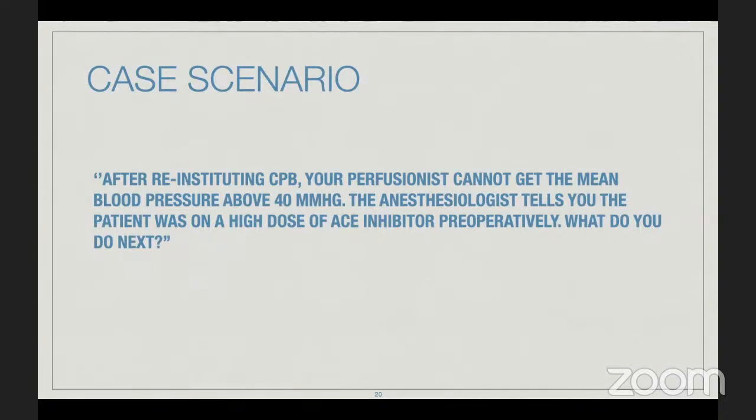So the most important part is basically the air comes from the pump from somewhere, most of the time from the reservoir. People are using suction all the time, but there is an air detector, and most of the air basically is not delivered, but there is some air that happens. If one of the lines is inadequate, you will see the air, but most of it is coming from the right side of the heart to the reservoir, and then it will be delivered afterwards. And most of the time from the tube and from the perfusion side.